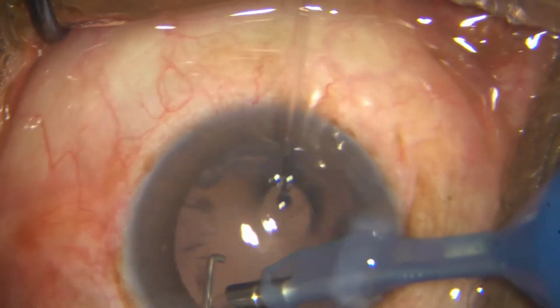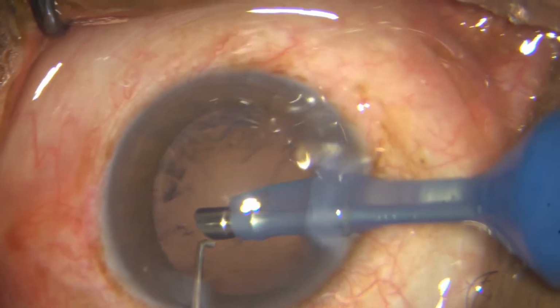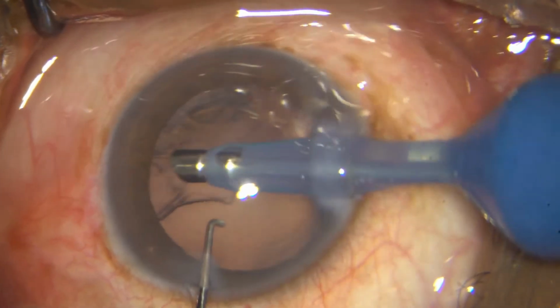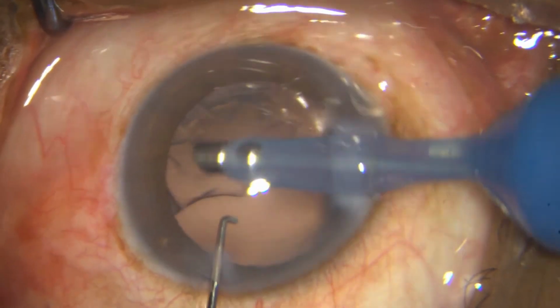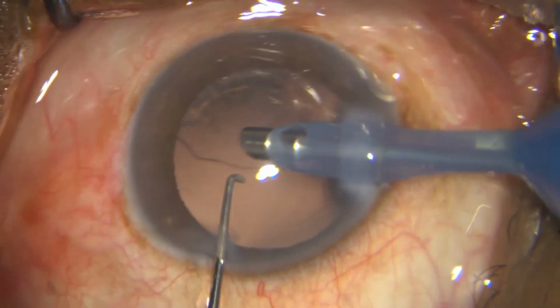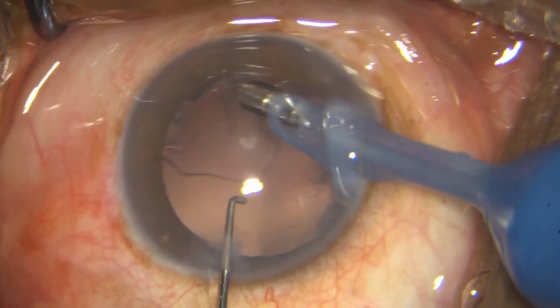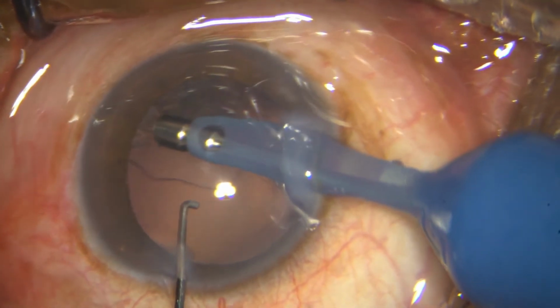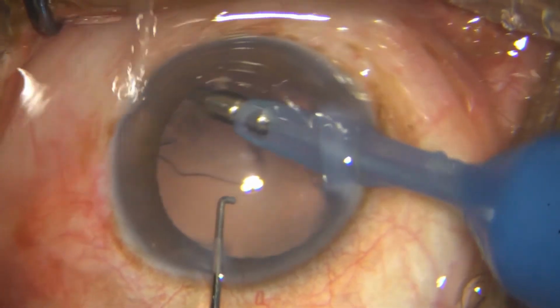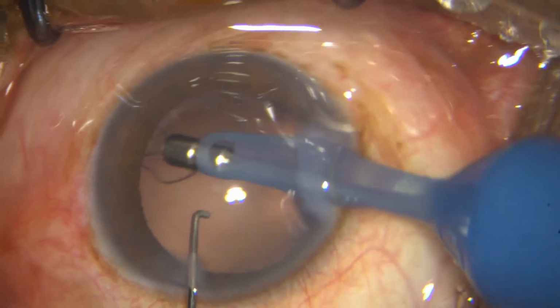So just taking out, trying to tease it out. So here I am trying to get as much as possible into my phaco tip. Once that hole occludes, I can just strip it off.